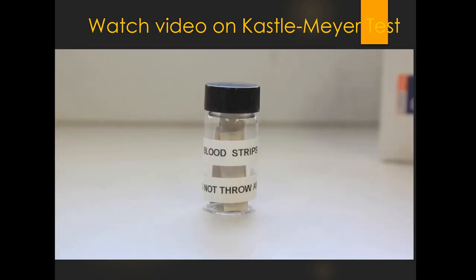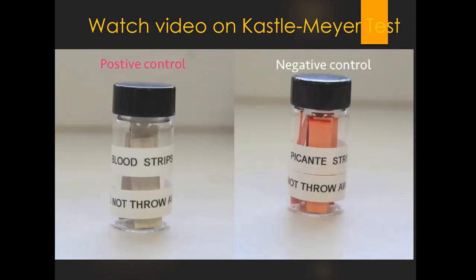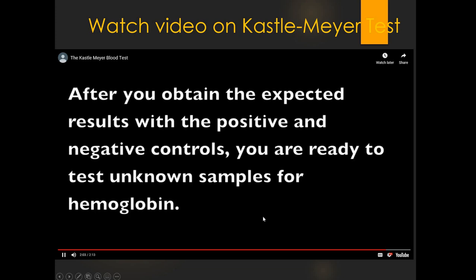The blood strip that we tested was a positive control. Since it contained hemoglobin, we expected it to turn pink when hydrogen peroxide was added. If we test another sample that does not contain hemoglobin, the swab should not turn pink. You must test positive and negative control samples before testing any unknown samples to ensure that your reagents are working properly and that you are following the test procedure correctly. Okay, so you do have to test a positive and a negative, and then you can test the sample. That's just to make sure that your reagents are good and there's no contamination going on.